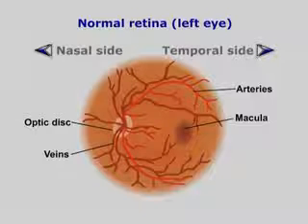Arteries are smaller and brighter than the larger, darker veins. Then focus on a vessel and trace its path to the point where other vessels are also converging. This is the optic disc, the part of the eye where the retinal vessels and the optic nerve emerge.